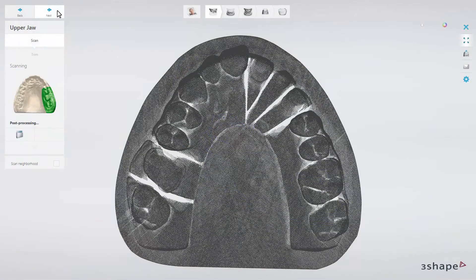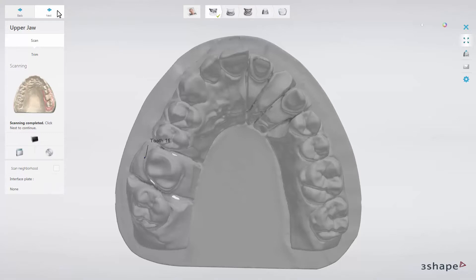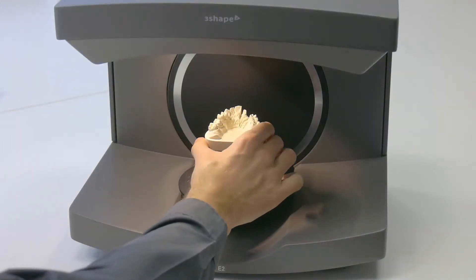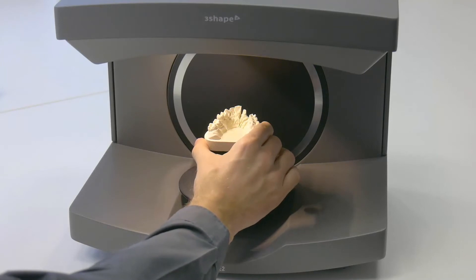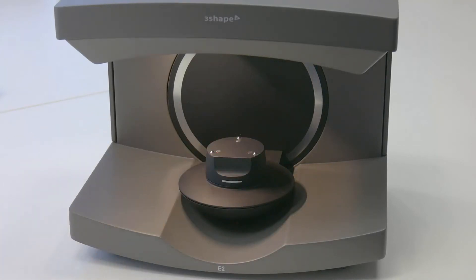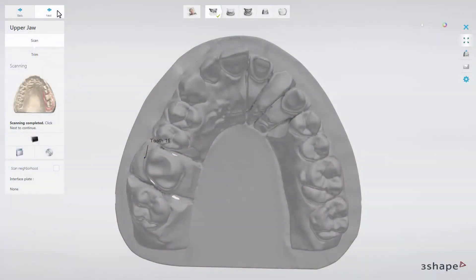Once the scanning process of the preparation arch is completed, you will see a 3D model of the scanned area on the screen. Take the preparation arch out of the scanner and click Next.